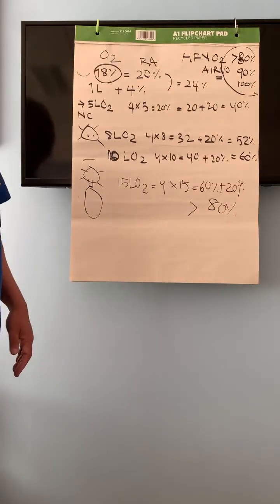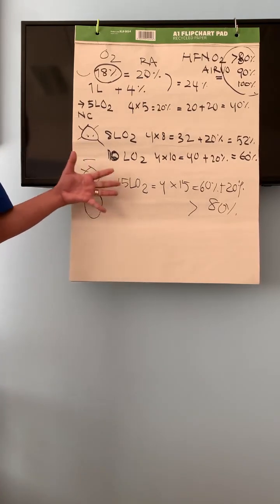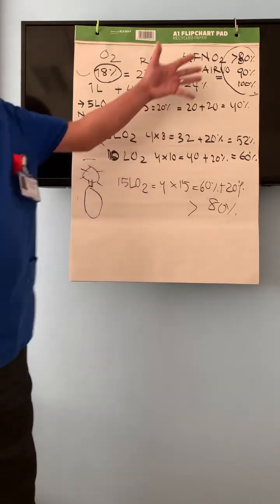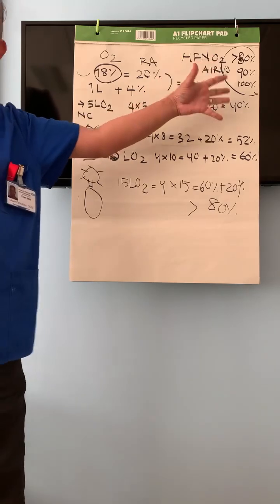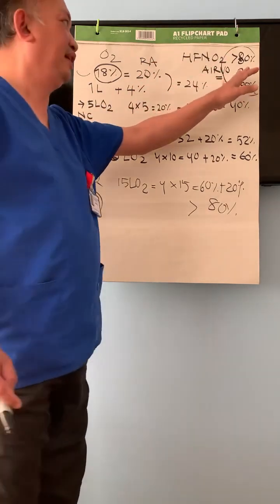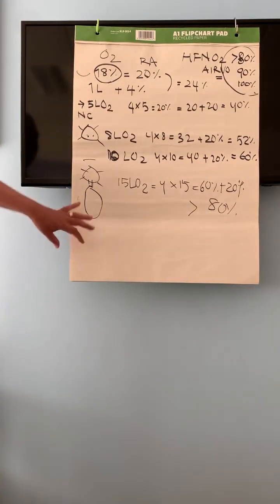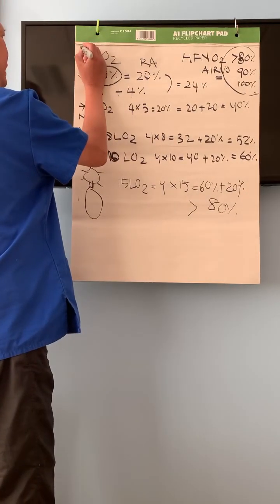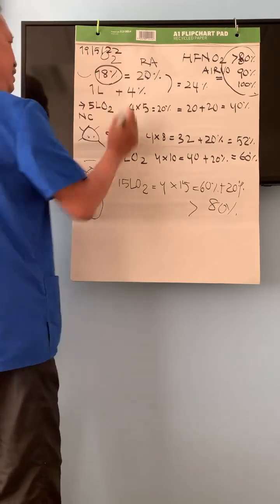The other devices don't have a water circuit to moisten the air, but the HFNO machine contains a water circuit to moisten the air, so that prevents dryness of the airway mucosa. This is the rough idea of how oxygen therapy works. Today is 19th of May 2022.